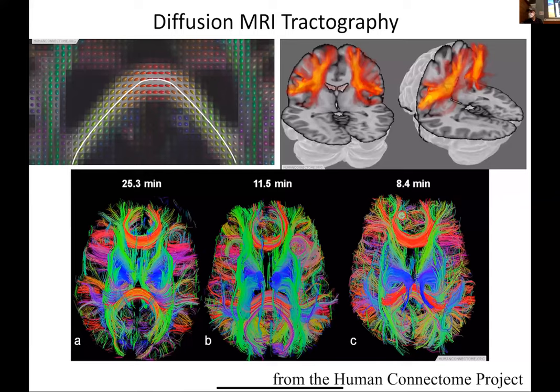Previous to this, when people were trying to track fibers, the only thing you might do is, for example, if you had a mouse or a monkey, you might be able to inject contrast agent into one part of a fiber and wait for it to diffuse slowly and see where it went. But obviously you can't do that without hurting the patient, and it takes forever and it only gets you one fiber. This is pretty amazing because it gets all the fibers all at once. Okay. Question?